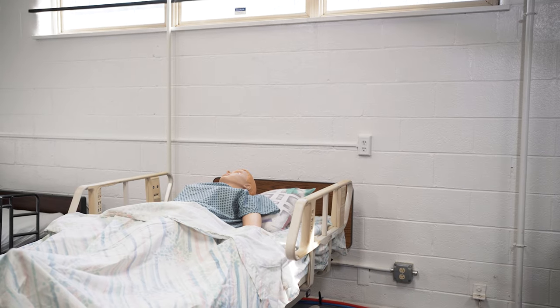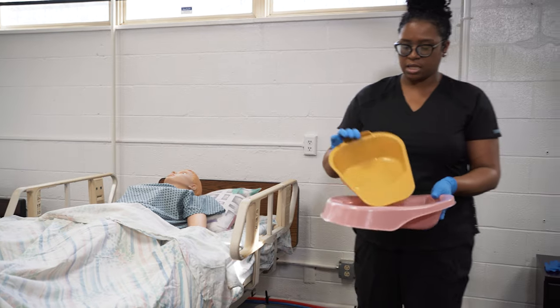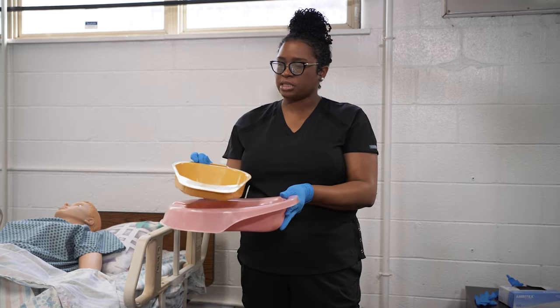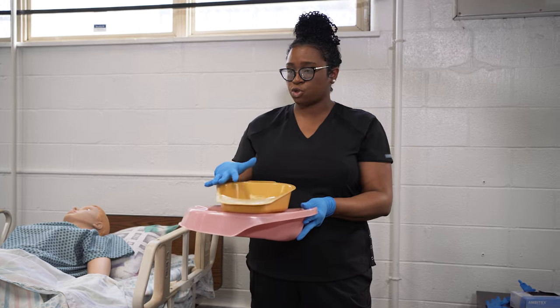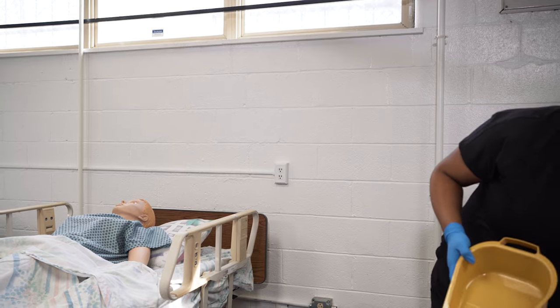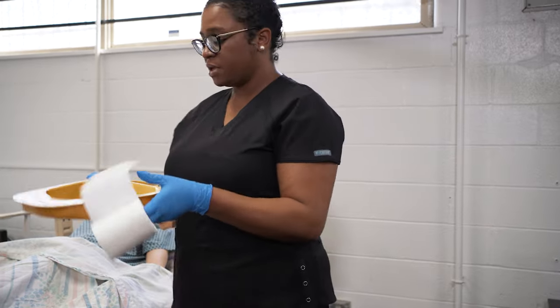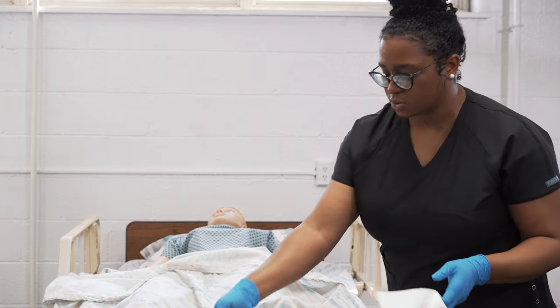Then grab your bed pan or fracture pan — make sure you know the difference between the two. The fracture pan is the more narrow pan and the bed pan is the larger pan. We use the fracture pan if the resident cannot assist with lifting their hips up or they have had some sort of surgery on their hip. So we're going to use the fracture pan today. Grab your fracture pan and toilet tissue. Anything with toileting is considered dirty, so place the dirty equipment onto a dirty surface — in this case, we can place it on the foot of the bed.